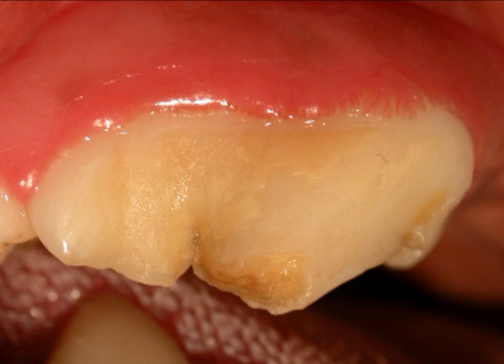This is the classic appearance of an uncomplicated crown fracture of the upper 4th premolar in a dog. The dark area shown by the arrow is the stained dentin which has been exposed. Note how thin the enamel edges are as shown by the blue arrows.